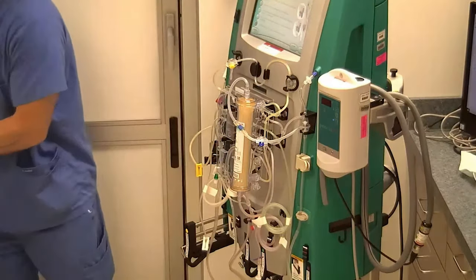A little tidbit too, if you ever do run into trouble and you can't get a hold of one of the dialysis nurses right away, there is a 1-800 number up here that directly contacts you with a live person at Baxter. All you have to do is repeat off to them the alarms that you're having. They'll want to know some pressure readings, and they will guide you step by step how to troubleshoot your machine.